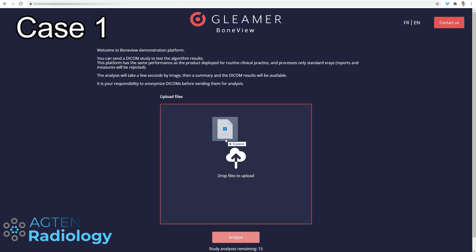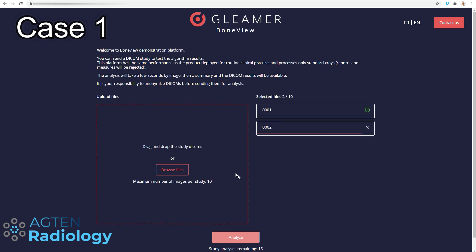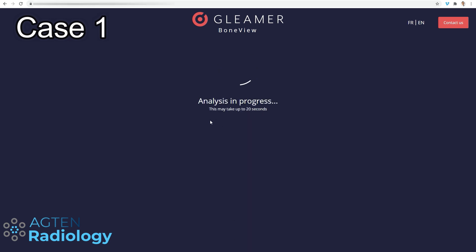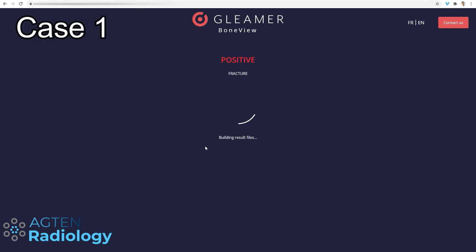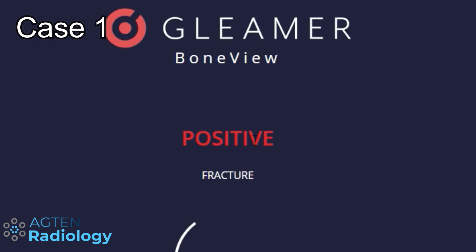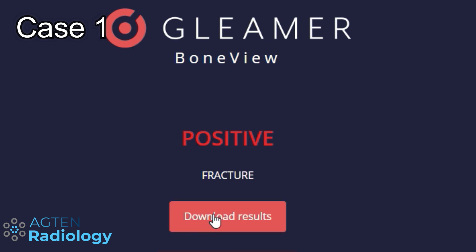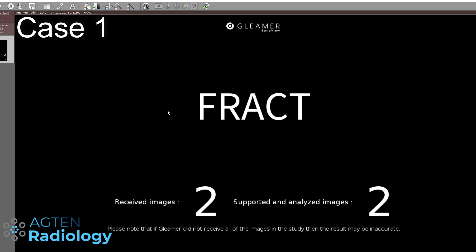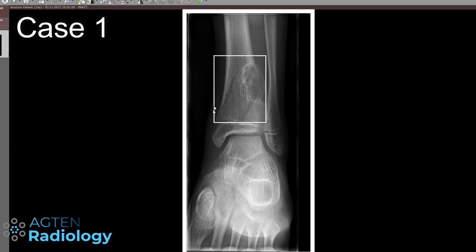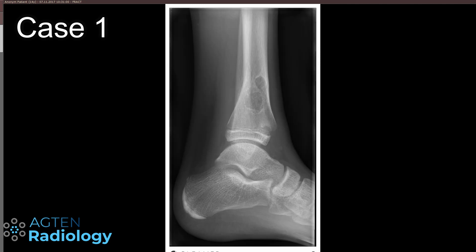We've dropped the cases into the portal. Normally you'd have the result right in your PACS system when you open a case. We press analyze and it's very quick — it shows us the result. It detects the fracture. Downloading the case, we can see it shows a fracture with the bounding rectangle, and the algorithm actually detected this fracture correctly. It was not detected on the lateral view, which is also probably pretty hard to see. Well done.